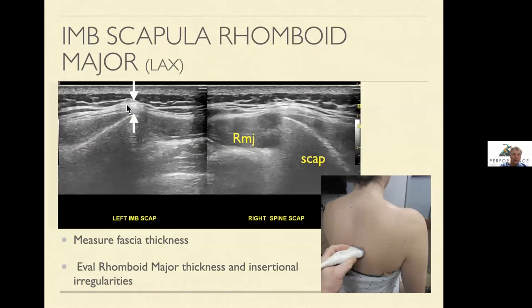The spinal accessory nerve fibers traverse down through this fascial layer and can create a burning sensation. You can compare rhomboid major down with the inferior border: scapula, teres minor, infraspinatus, and then rib and lung here. Get good at following the entire medial border up and down. Then slide over and look at the rhomboid attachments to the spinous processes, which is another lecture.